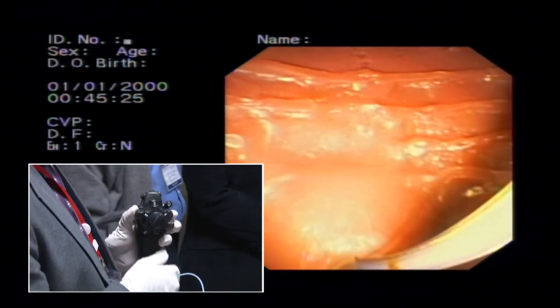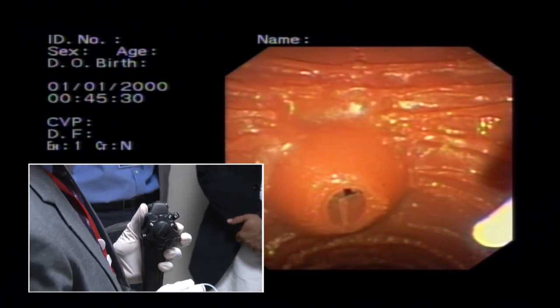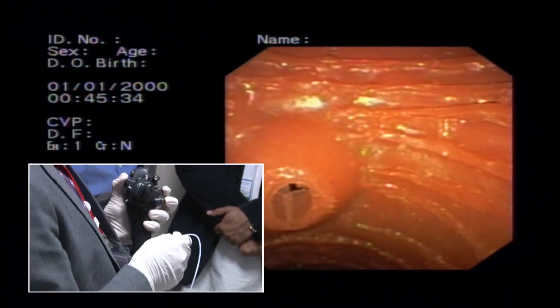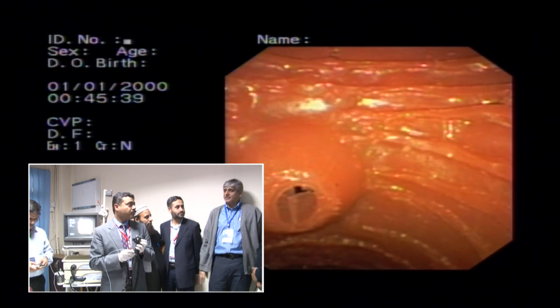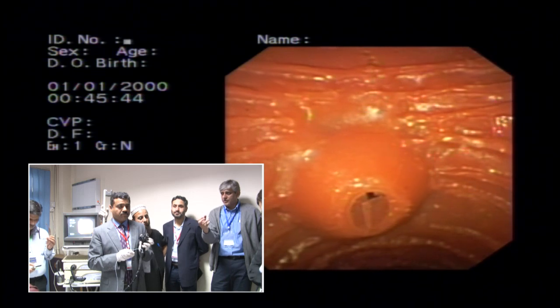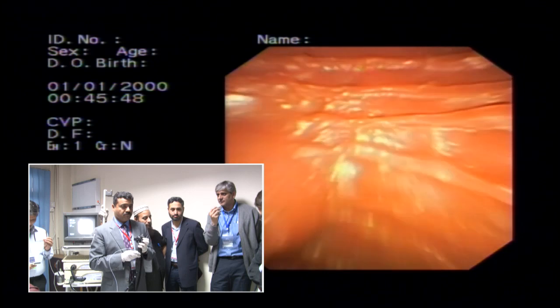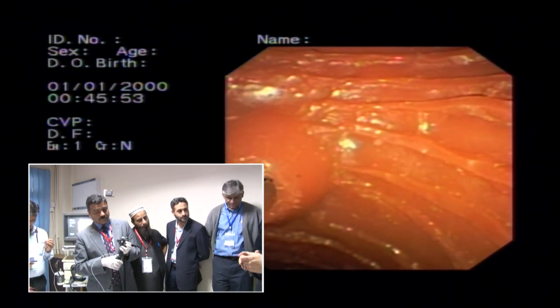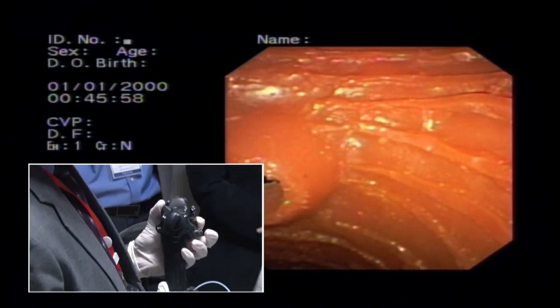That's all. And it's usually, actually, if you're sensible and you don't rush, again, I think ampullary carcinoma is an excellent example of being patient and looking at where you're going to poke. They bleed. Not excessively, but they bleed enough to actually make the whole thing obscure. So before you poke, you need to try and go through and see where the opening is. But when you are looking at the ampulla and you just sit there and just periodic suction. When we do that suction, let it go, suction, let it go.